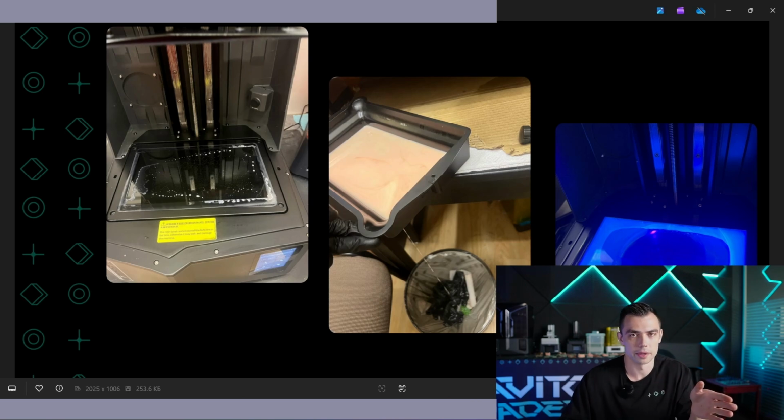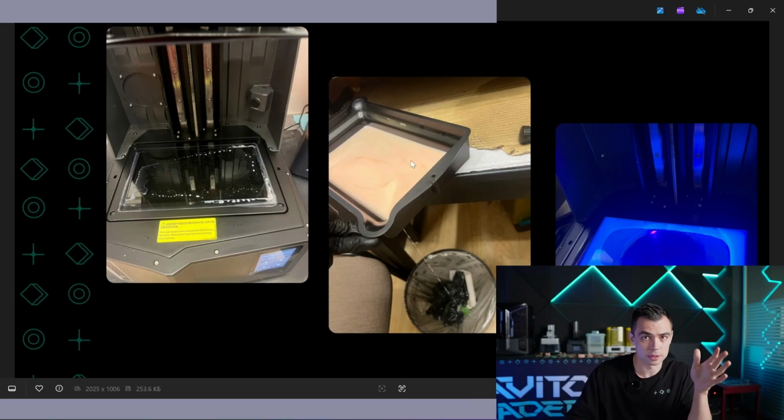We had performed wet cleaning of our 3D printer and made a tiny hole in the surgical guide resin container. It's not actually the surgical guide resin container, but just a tank for models. But anyway, it's not about that.